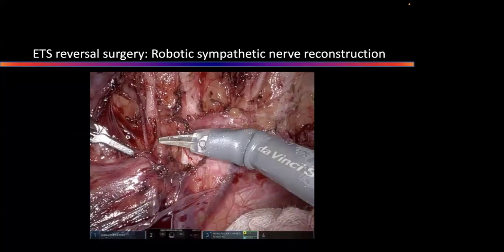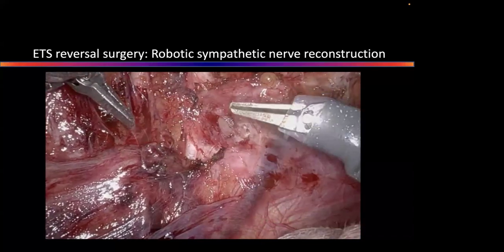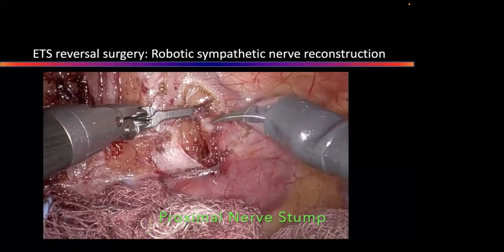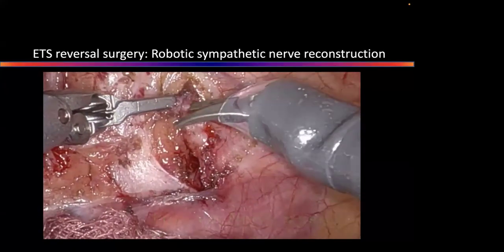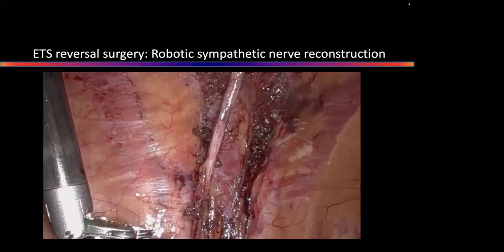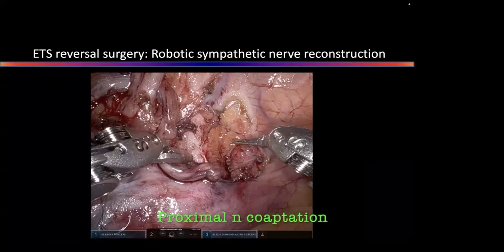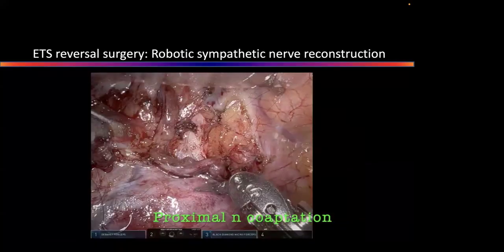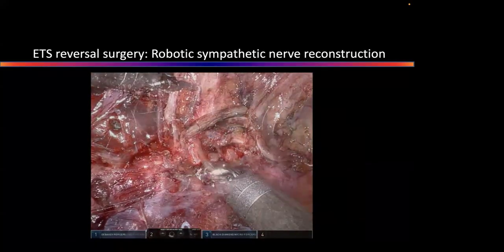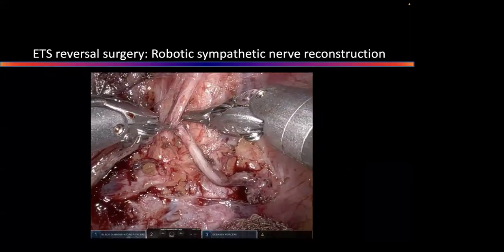I do the reconstruction by robotic surgery and use the patient's own intercostal nerve to reconstruct the sympathetic chain. It's a great surgery, possible only by robotic system. We identify the proximal and distal cut end of the nerve and then reconnect the nerve using interrupted sutures of 8-0 nylon. The patients report a significant improvement in their quality of life after around 8 to 9 months.